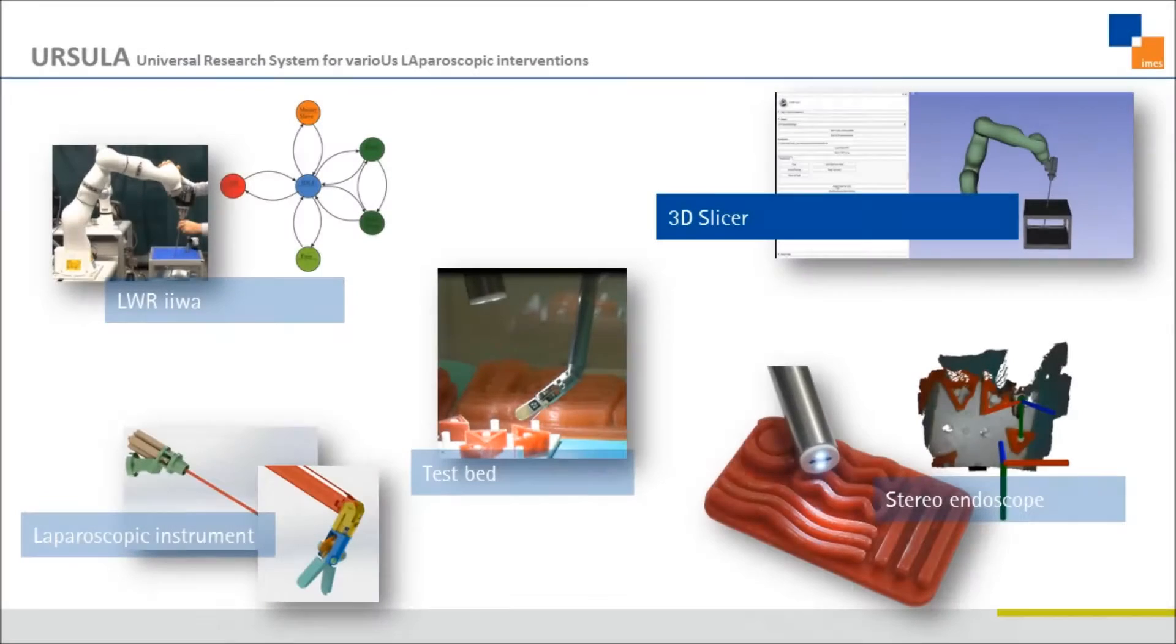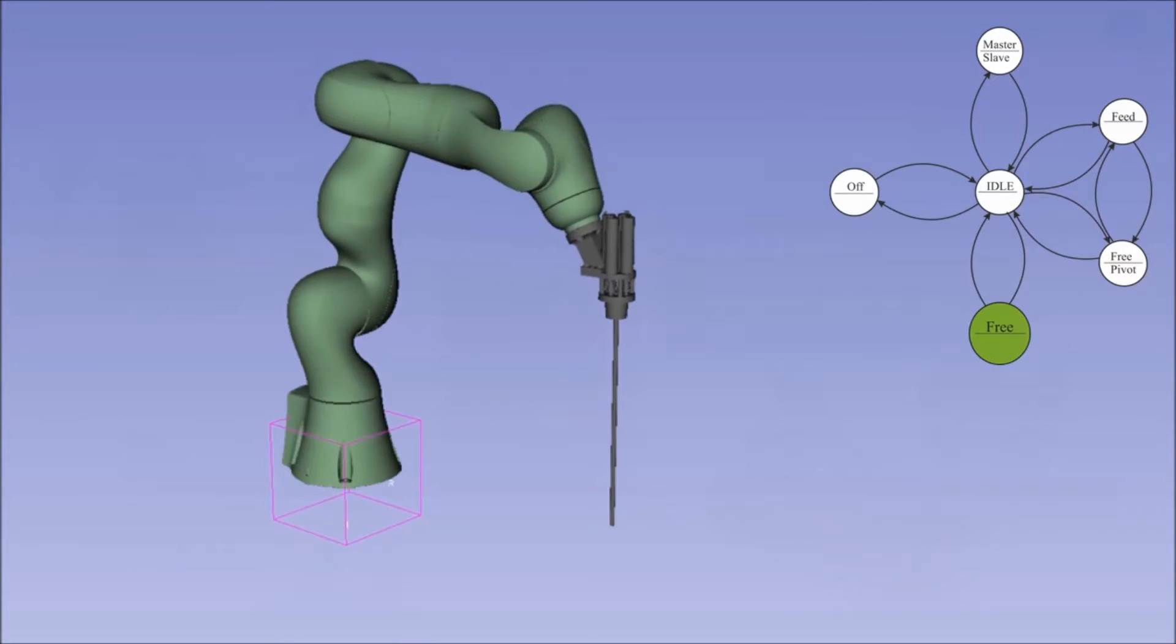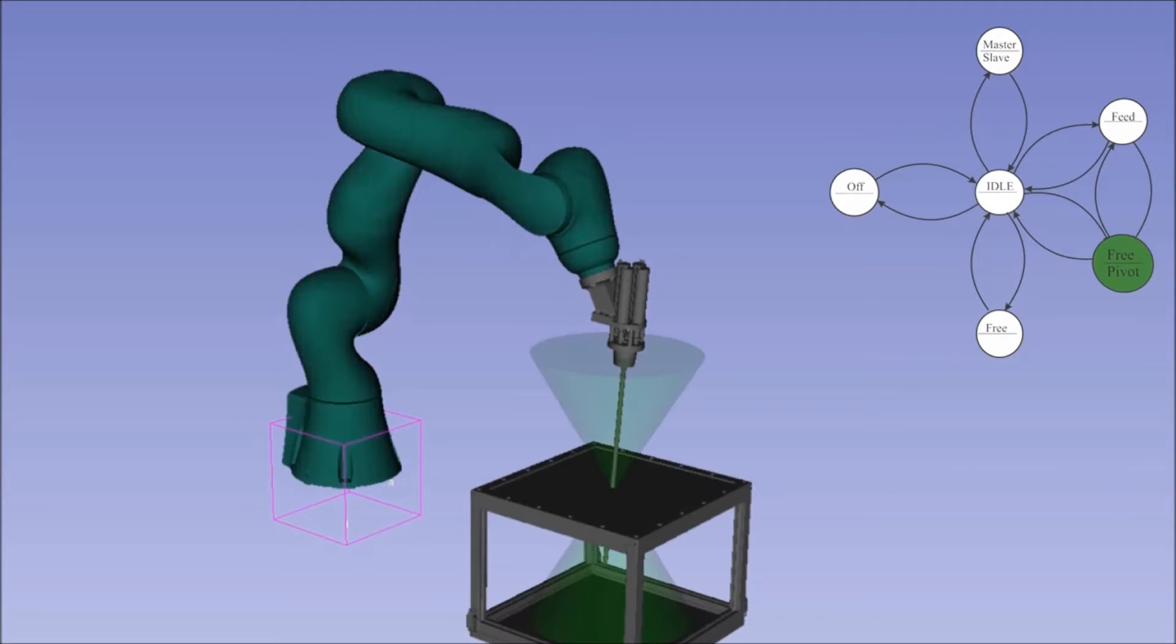All system components are integrated in 3D Slicer. Here we see the visualization of the robot in 3D Slicer. We are using the current position of the robot to automatically set the entrance point of the instrument.